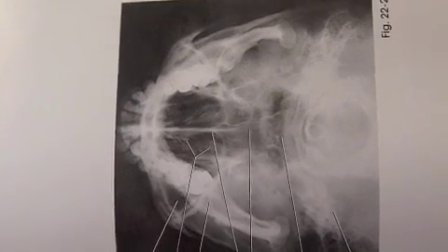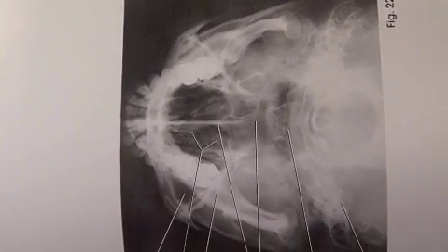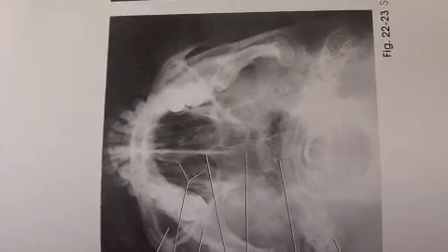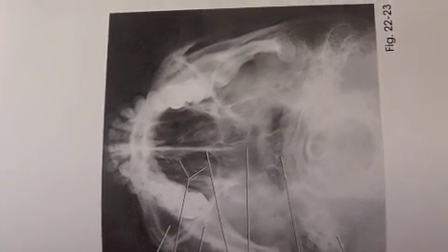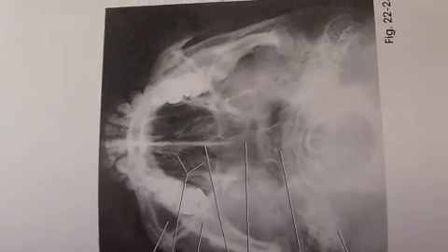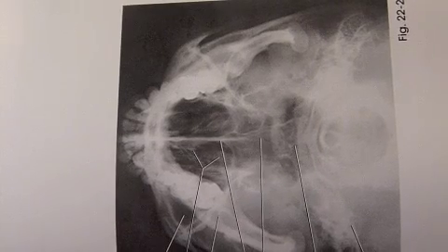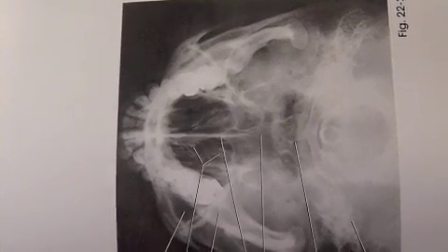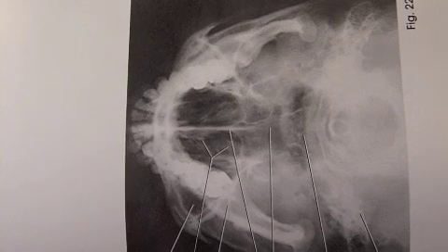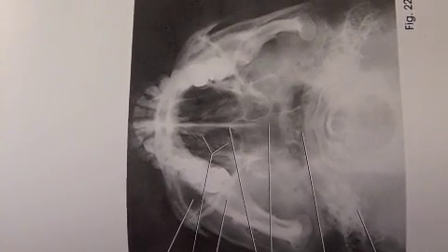The structures you're looking for are the maxillary sinus, ethmoidal sinus, the mandible, the vomer, the sphenoidal sinus, the pharynx, and the petrosa. The criteria for this is equal distance from the lateral border of the skull to the mandibular condyles on both sides, indicating that the mid-sagittal plane is perpendicular. You want the anterior frontal bone superimposed by the mental protuberance, indicating that the IOML is parallel to the IR. You want the mandibular condyles anterior to the petrous pyramids, and you are looking for air fluid levels.